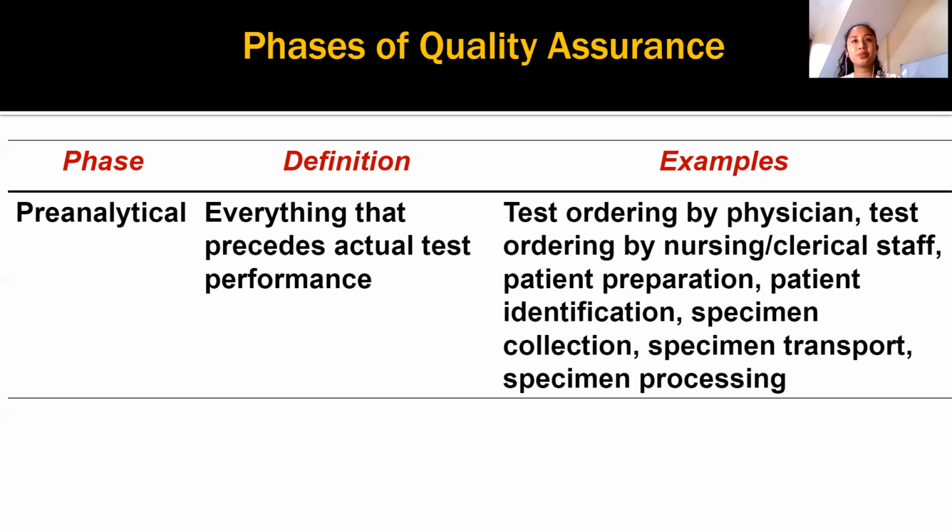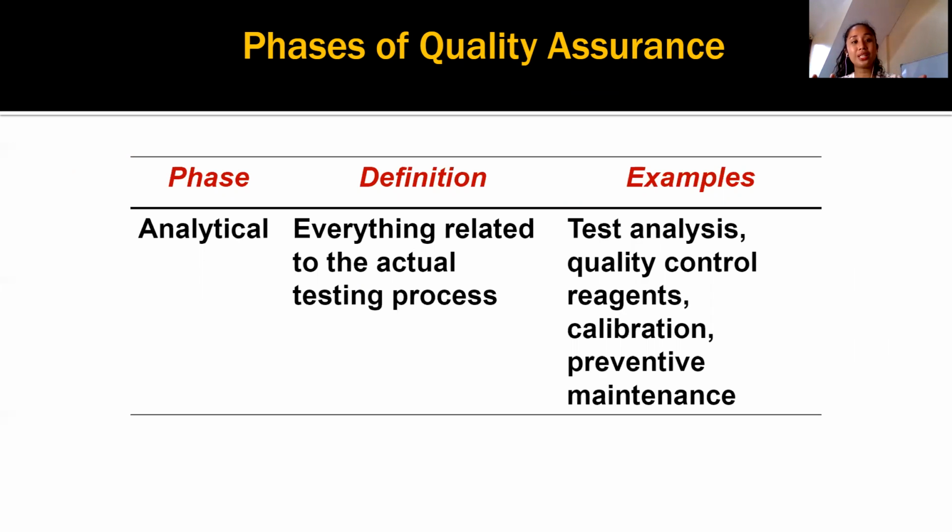So, class, those are what we watch out for when it comes to quality assurance. In the analytical phase, during the actual testing process, this includes your test and analysis. To ensure that the analysis is correct, make sure that your medical technologist is well trained. Especially now, many medtechs, class, have gone into PCR testing, which is not really done routinely. Since the dawn of COVID-19, so many medtechs have had to train in a very short period of time in the techniques of PCR testing. So, our medical technologists were thrown into it. And so far, many are doing a great job in that phase.